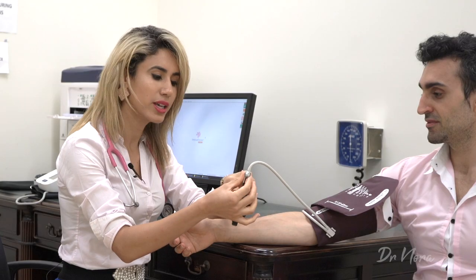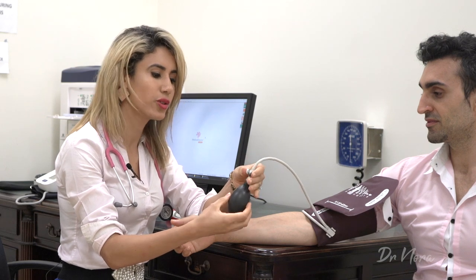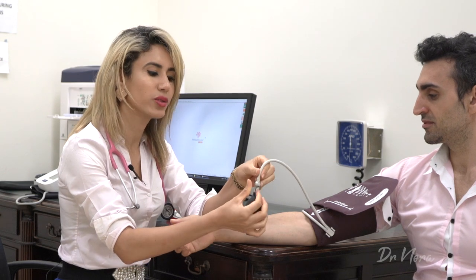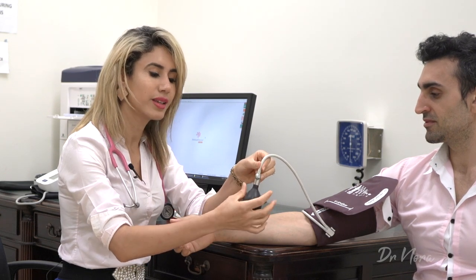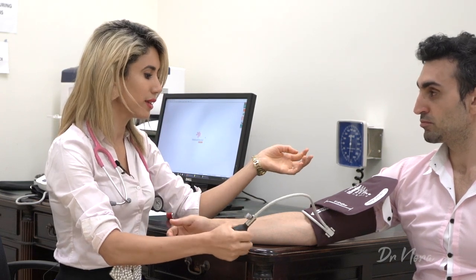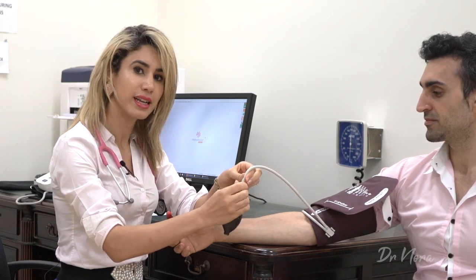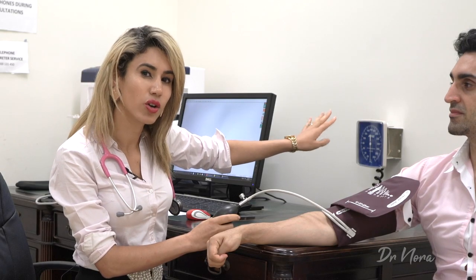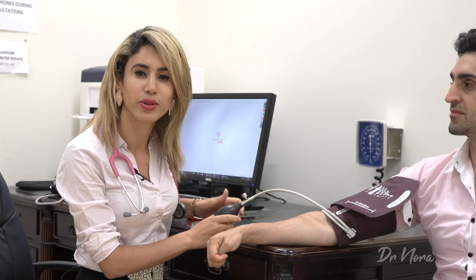Before you get started, you always need to make sure that the valve on the pumping device is closed, because if it's open while you're pumping, you're not going to get any air into the cuff. Always make sure the valve is closed by twisting it until it locks into place. As for how much to inflate: if I know the patient and their blood pressure, I'll inflate by an extra 30 to 40 millimeters of mercury above their known reading. If the patient is new to me, I'll go up to about 160 to 180 on the dial and count down to find where their pressure lies.